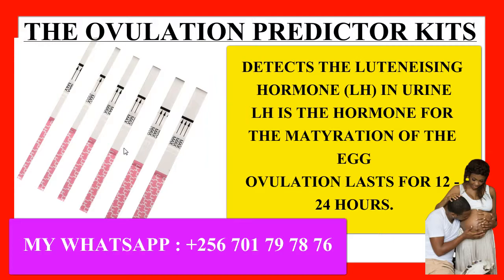So if your ovulation is, let's say, 2 days from today, or it's maybe happening tomorrow, and the line is darker today, then we recommend you begin having sex since yesterday, today and tomorrow. The main reason is that sperm can stay in a woman's system for some good number of days, that is 3 to 5 days.